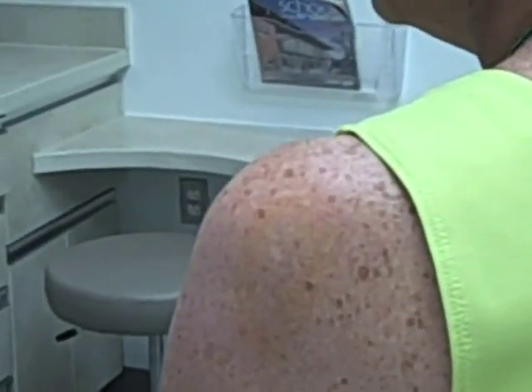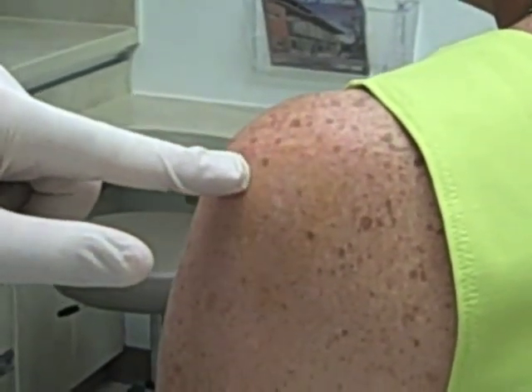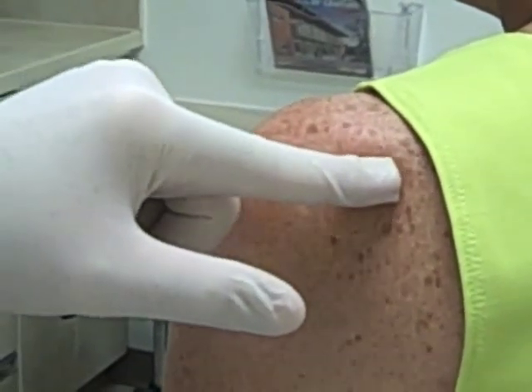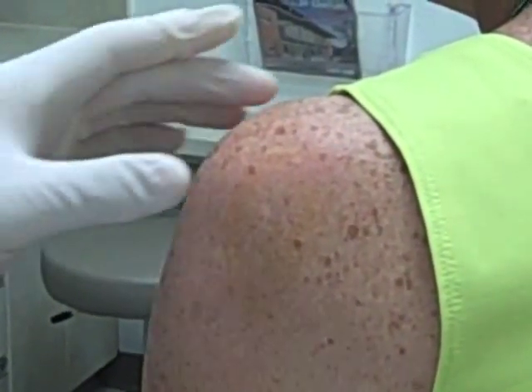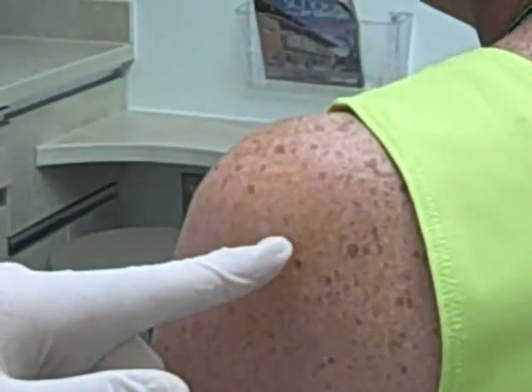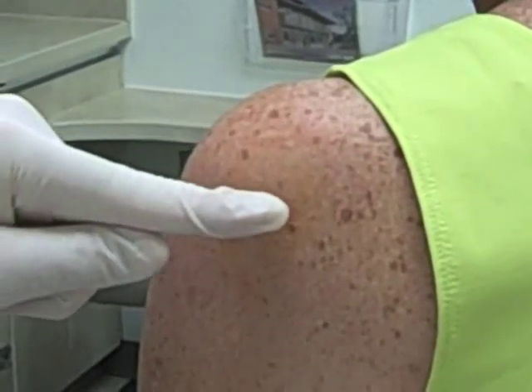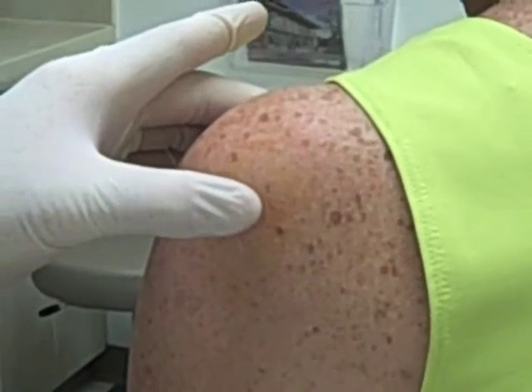What we are going to demonstrate today is a posterior approach. With the patient in a seated position, we will identify the important landmarks for the injection. The two structures to identify are the inferior border of the acromion and the coracoid process anteriorly. The injection site is approximately one centimeter inferior to the inferior border of the acromion, lined up with the coracoid process on the anterior aspect.